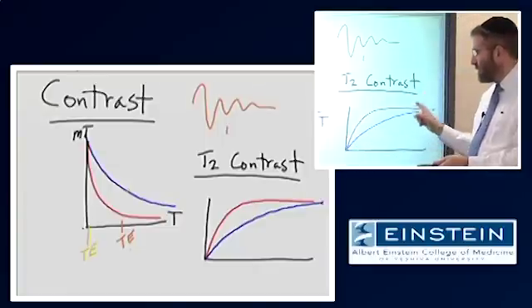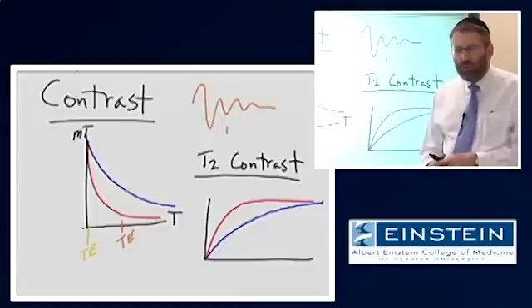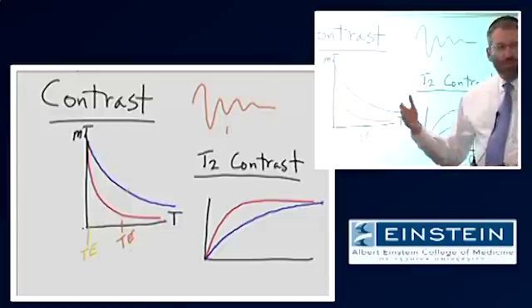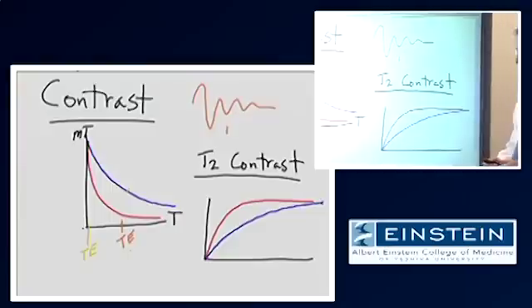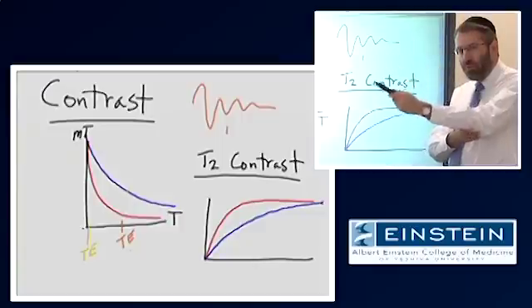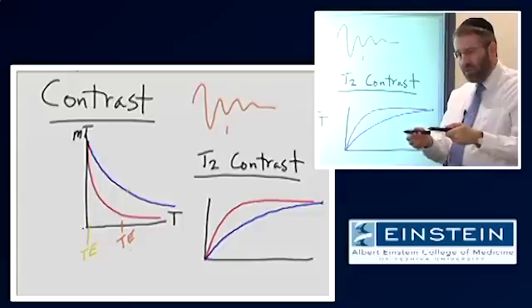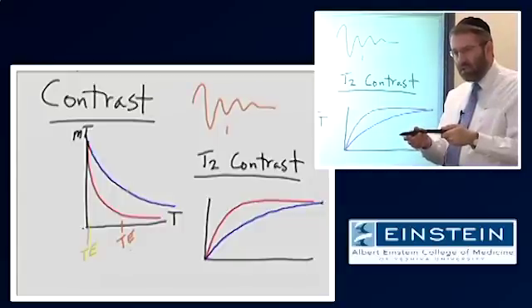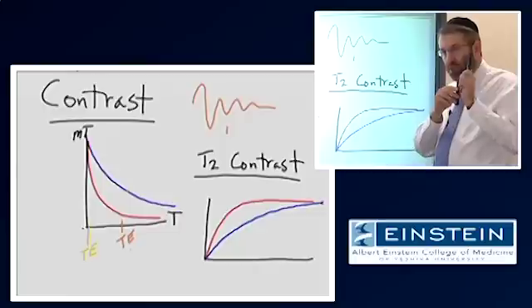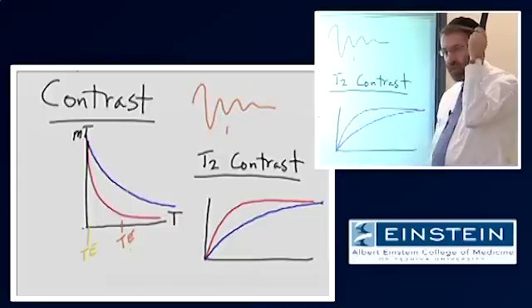If we repeat this, and the reality is that we need to repeat this and measure this sample multiple times to generate an image. From a single measurement like this, we'll never be able to generate enough information to generate a usable signal, let alone an image. But if we take our longitudinal magnetization, put it in the transverse plane, wait as it relaxes and measure the signal at some time TE, and then while this is all going on, that longitudinal magnetization is also recovering. And if we wait long enough, everything catches up and it becomes fully relaxed. We're back where we started.